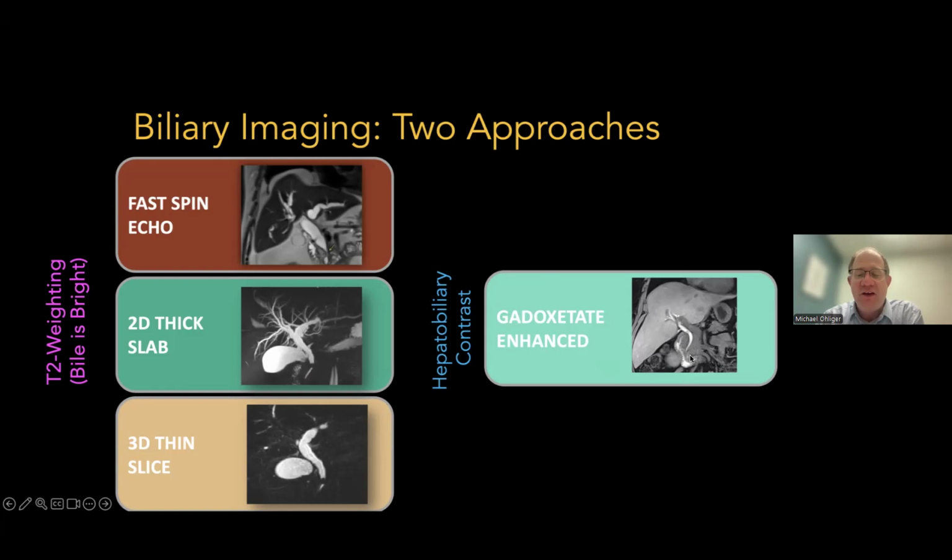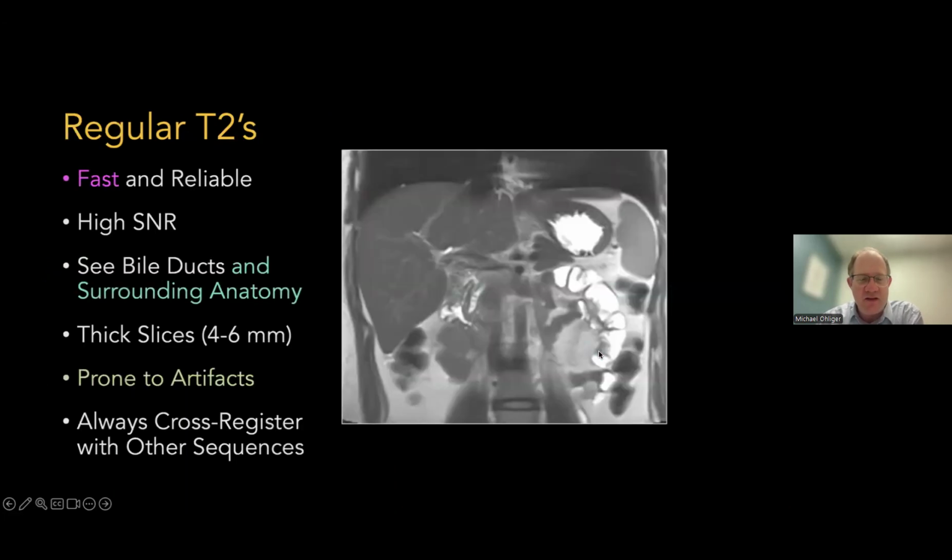And so it's really good at seeing the bile ducts, and it's very similar to what HIDA does. In MRI, if you know about any contrast agent, as a gastroenterologist, you should know about Eovist, because this one comes up a lot, and all the other contrast agents are basically the same. This is the only contrast agent that does something like this. But I have a separate section on that. And so I'm going to talk about each of these in the middle.